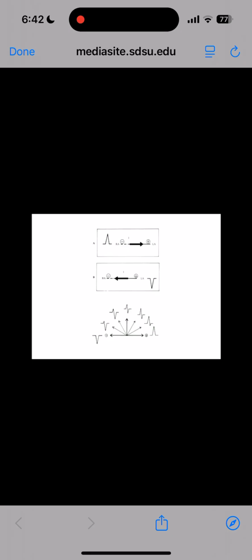If, as an example, and I'll use this apple, my heart was positioned this way in my chest, and I put the negative lead here and the positive lead here, what you can see on the very top, since I happen to get the lead directly lined up with my dipole, all I would record is an upward deflection. If somehow I reverse them and put the positive up here and the negative down here, all I would record is a downward deflection. So the recording that you get is based on the position of the lead and the position of your dipole.